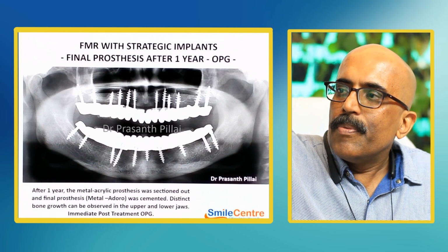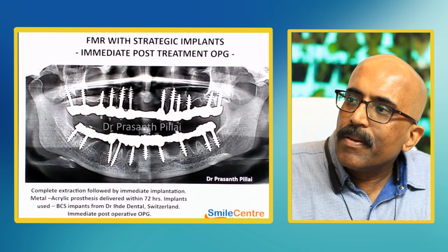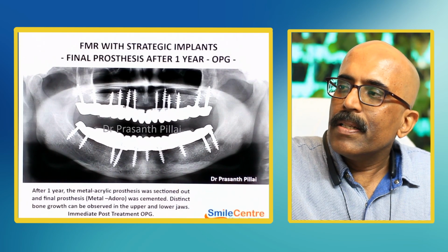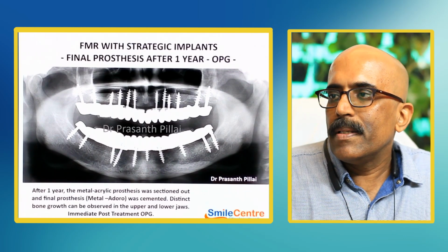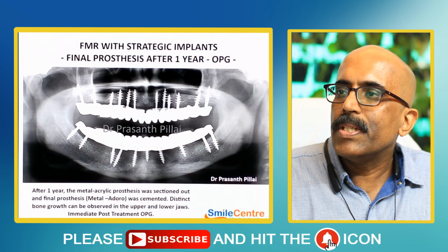You can see there was a very bad situation in the previous X-ray where there was a lot of bone loss. Now all the bone loss has been reversed, and fresh bone has started growing all around, just because the implants have started stimulating the bone and the bone starts regenerating. The native bone starts regenerating, and automatically the entire area gets filled up. That is the biggest advantage here.